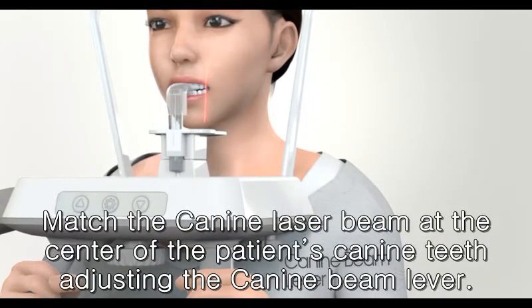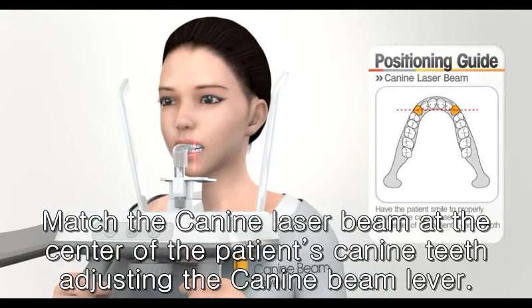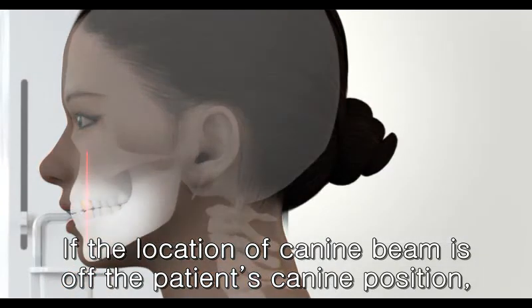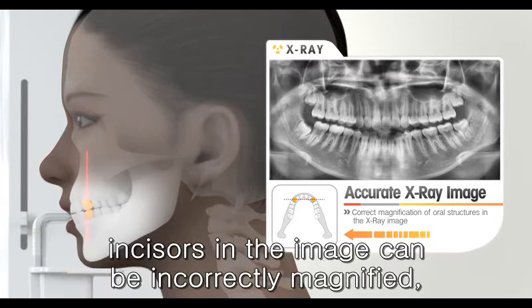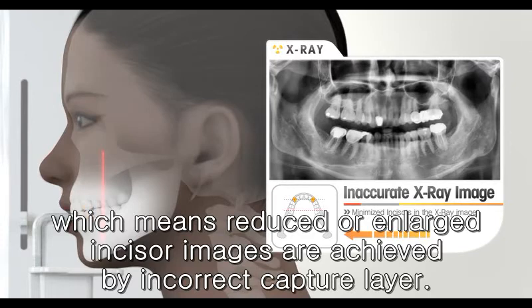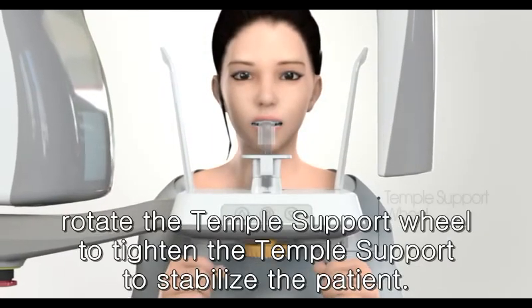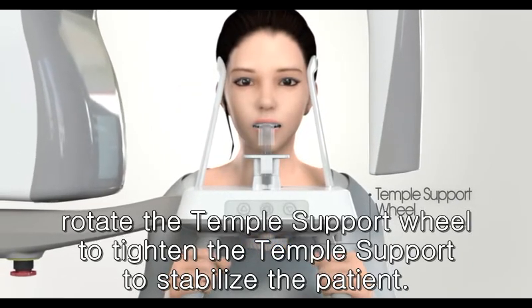Match the canine laser beam at the center of the patient's canine teeth, adjusting the canine beam lever. If the location of canine beam is off the patient's canine position, incisor image can be incorrectly magnified, which means reduced or enlarged incisor images are achieved by incorrect capture layer. When everything is ready, rotate the temple support wheel to tighten the temple support to stabilize the patient.